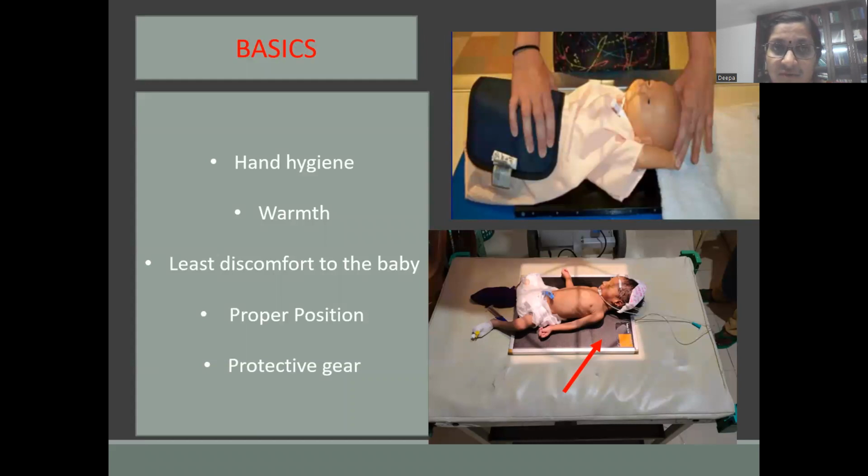Moving on to the basics of X-ray in NICU. As everything in neonatology starts with hand hygiene, infection control is very important, especially of the caregiver and the technician who is going to take the X-ray. And the role of the staff nurse would be to ensure that the baby remains euthermic, doesn't go into hypothermia, and takes care of the comfort of the baby, quietens the baby if the baby is fussy, so that we get a good picture. And from the technician's point of view, the most important first responsibility would be to properly position the baby. So how do you position the baby in NICU for taking X-rays?